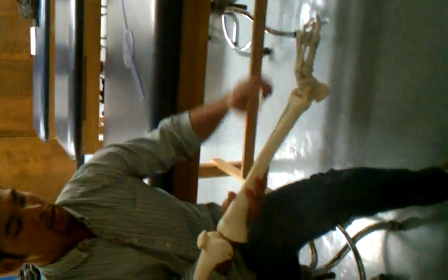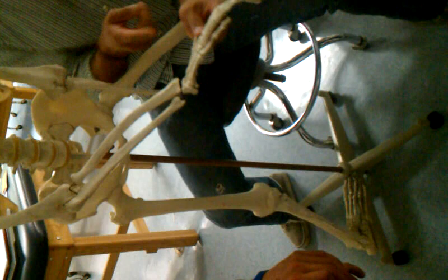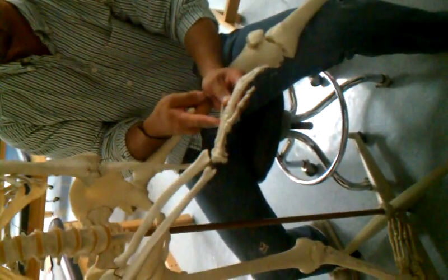That's just the knuckle — this whole bone is your metatarsal. It's hard to see on skeletons because there's no tissue on them. On the foot, you don't line up with the toes. Some people can point their toes in weird directions but can only move their metatarsals so far. The metatarsals are the longer ones — same with the hand. You line up with those, not the toes.